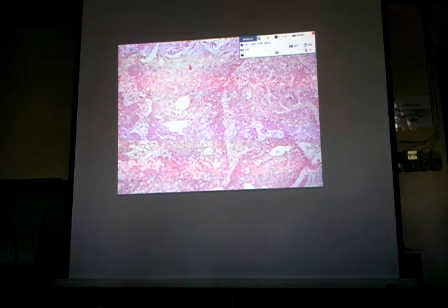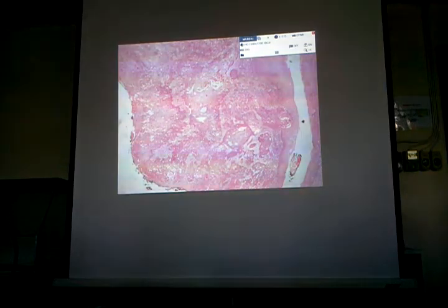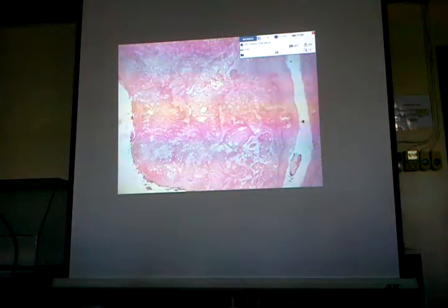When tumor cells still resemble the regular, the benign cells in morphology, or if they are still performing the expected function of the normal cell, the tumor is classified as well differentiated. So normally squamous cells produce keratin, and because these tumor cells produce keratin pearls, this malignancy should be classified as a well-differentiated type of malignancy.